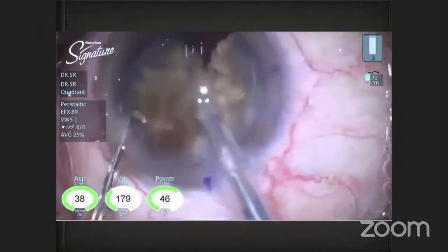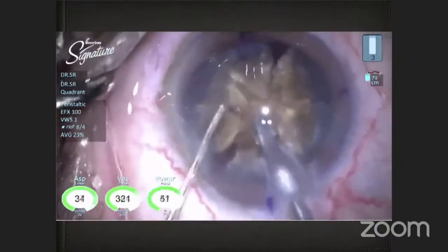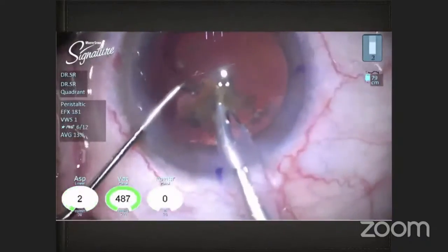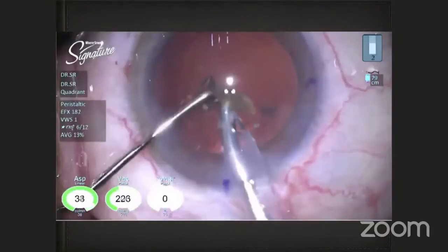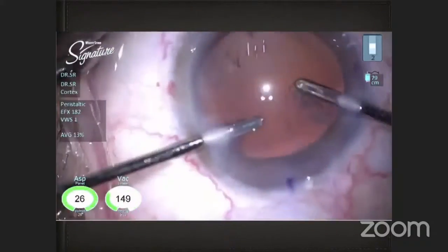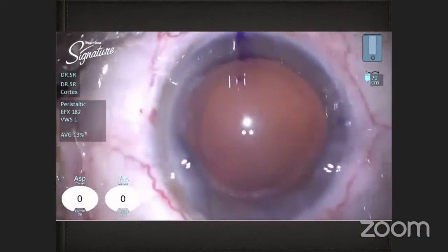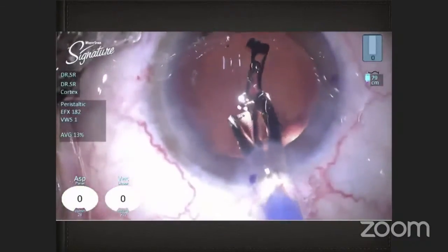I'll talk a little bit more about the emulsification in my second video, which I'll be showing. But suffice to say, it is important that you have chopped it down into multiple pieces before you go ahead with the emulsification process itself. Subsequently, there is usually very little cortex left in these cases. I go ahead with the IOL implantation here.